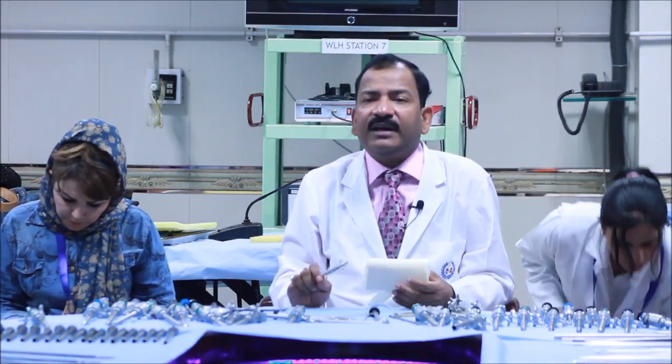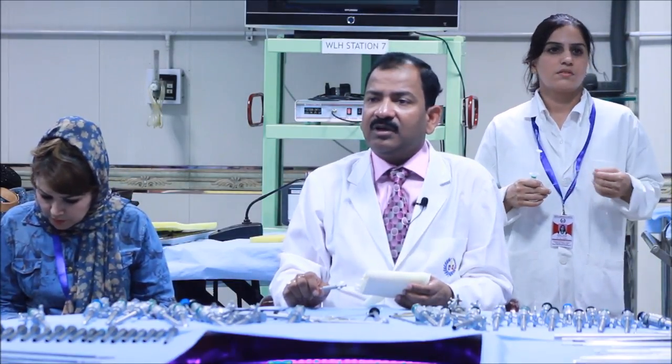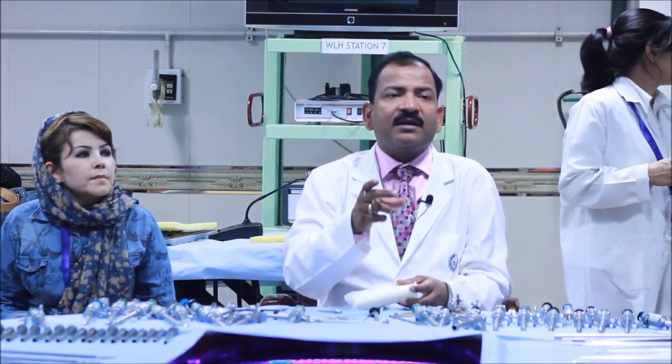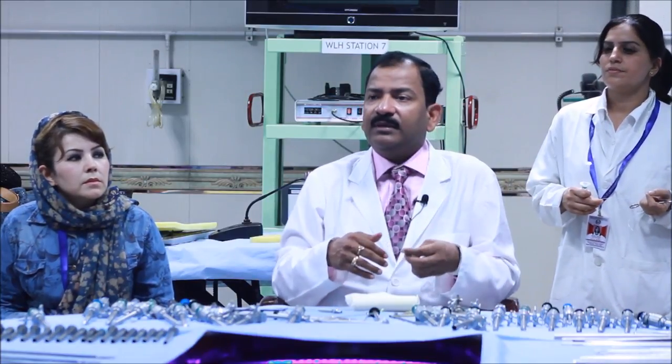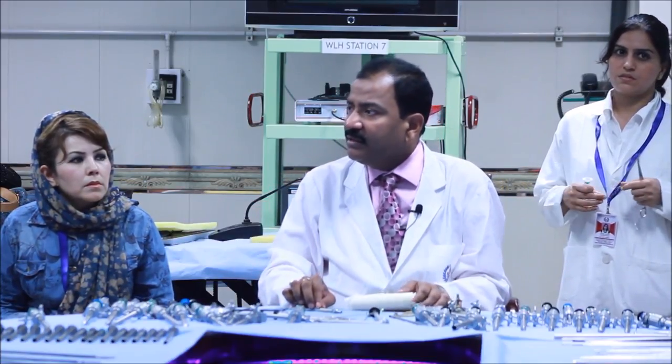One advantage, never ever in your life you will damage the aorta or vena cava, because the aortoiliac axis is approximately 5 centimeter above the sacral promontory. So, just 5 centimeter above, aorta is bifurcated into common iliac vessels. So, there is no point I can damage the aorta or vena cava if I am pointing towards the anus. Second advantage is, if you are pointing towards the anus, you are going to the hollow sacral curve, and that area does not have the vertebral body.